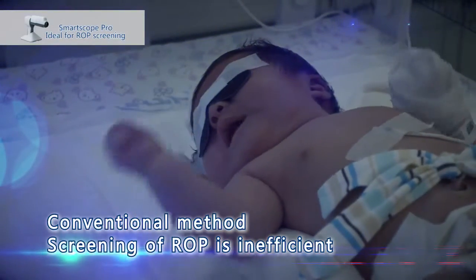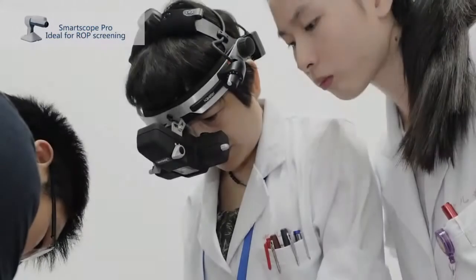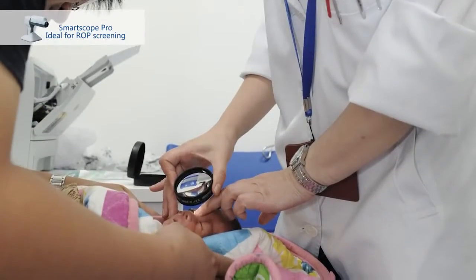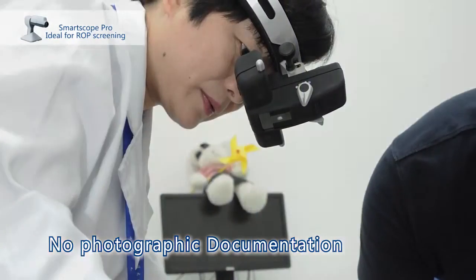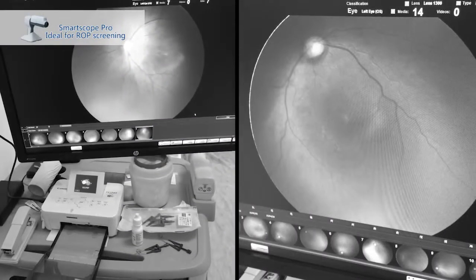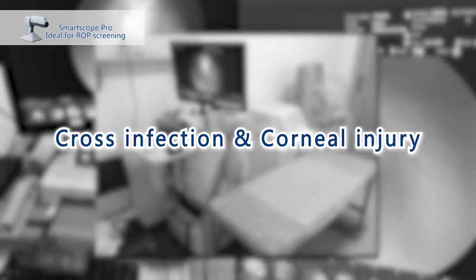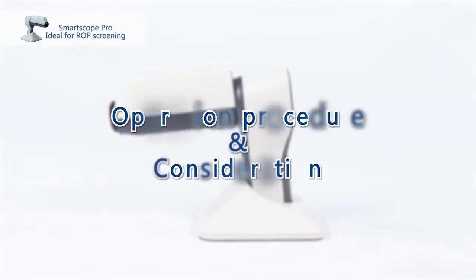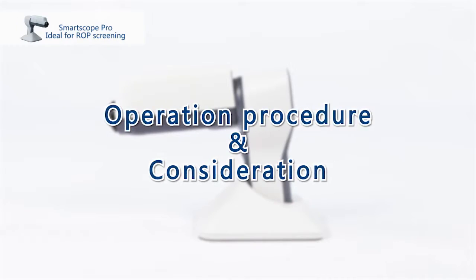Without an appropriate screening tool, the screening of ROP is inefficient. An indirect ophthalmoscope can only be used by ophthalmologists, and no medical evidence can be photographically documented. A contact fundus camera may cause cross-infection and corneal injury. It also cannot be operated in the incubator. Smartscope provides you a non-contact, convenient way to do ROP screening.